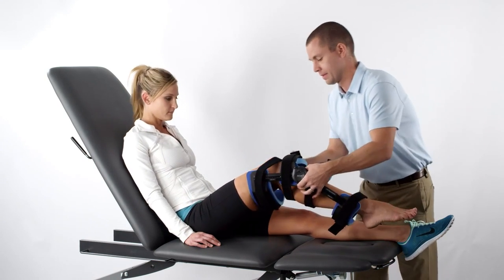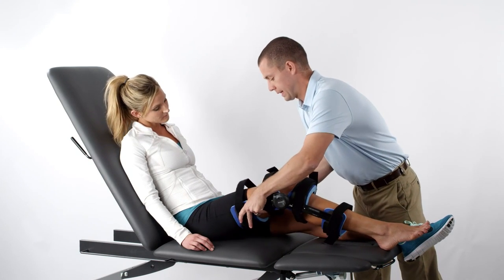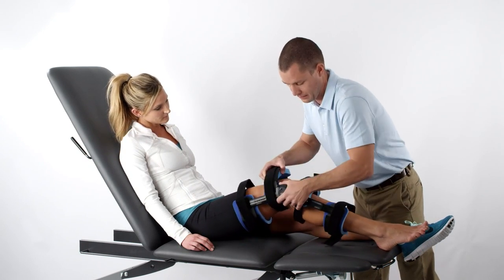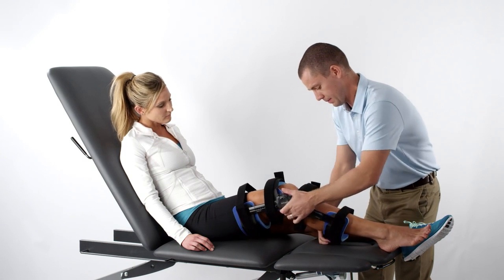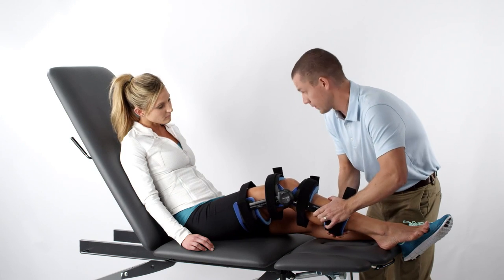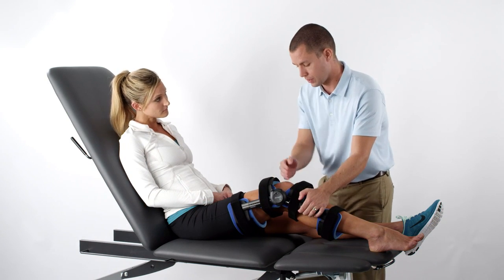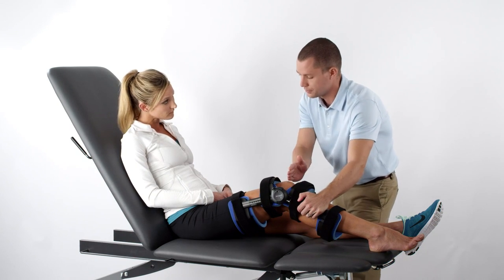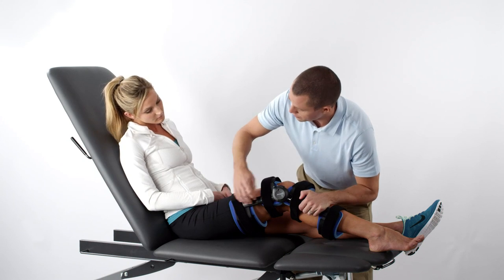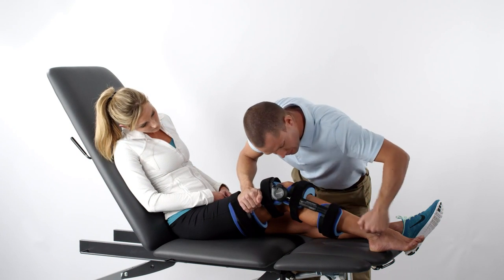Begin by positioning the contour cuffs on the leg, starting with the most proximal thigh cuff and working down to the distal calf cuff. Next, align the device so that the center of the tension spring cover lines up with the joint axis of the knee. Then align the struts by following the long bones of the leg.